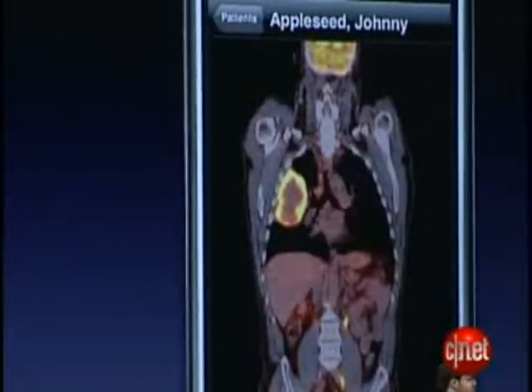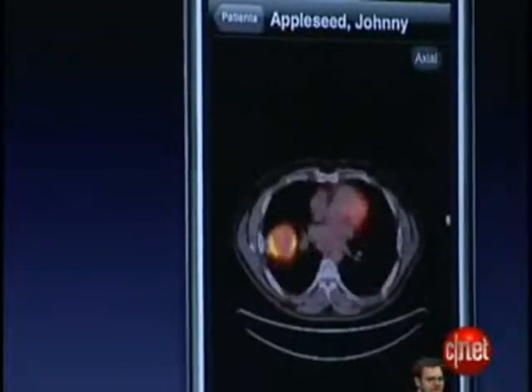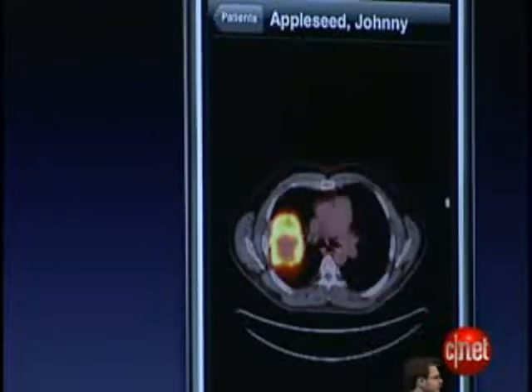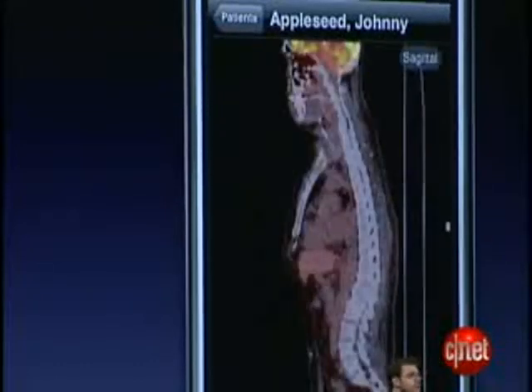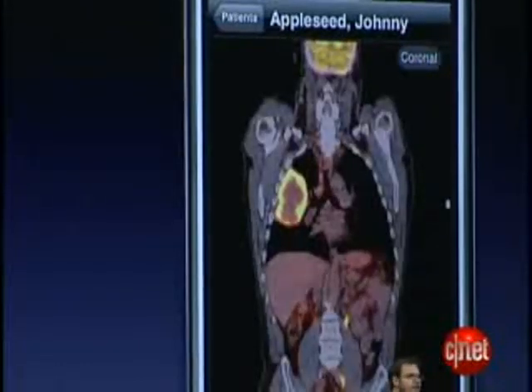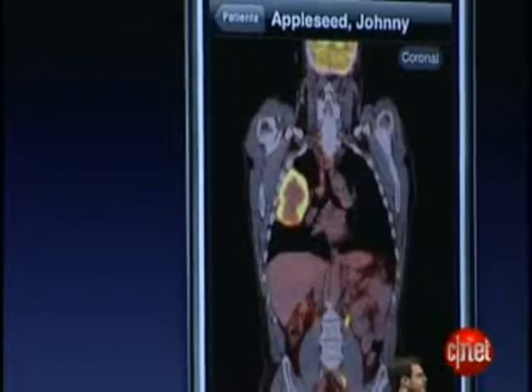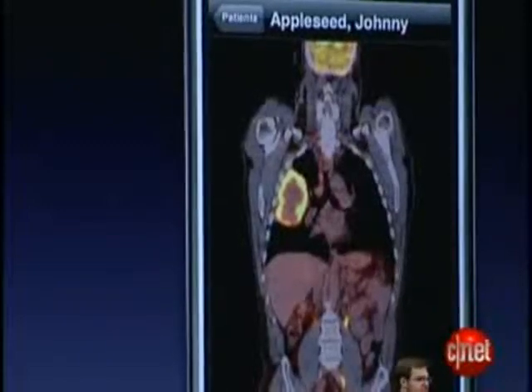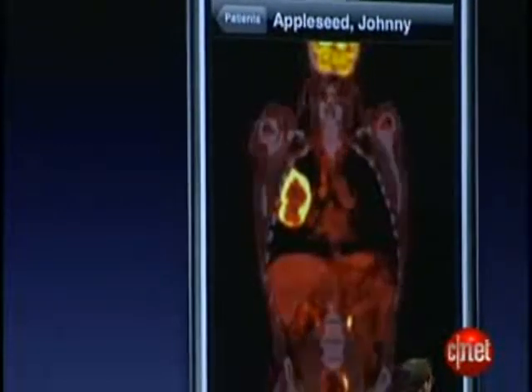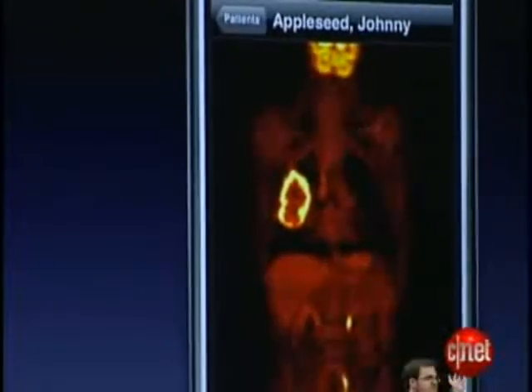Tap View to change the viewing plane so that you can see the data from the bottom, from the side, and from the front. Early on we recognized the potential of the iPhone and we set out to see if this was even possible.